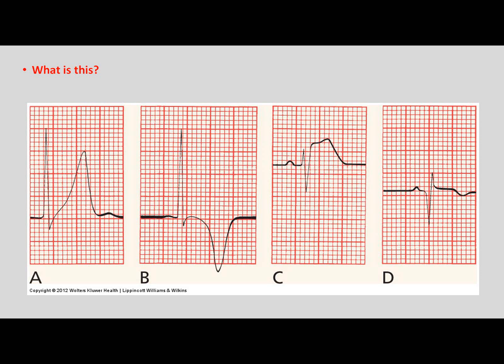What happened to the T wave? Wow, tall. Look at it. It's almost as tall as the QRS. Normally it's not that tall. So when you have peak T waves, what are the two possibilities? Perfect. I am so happy.